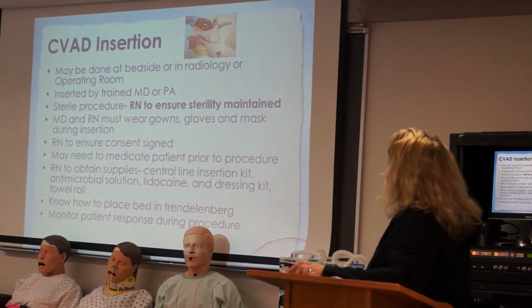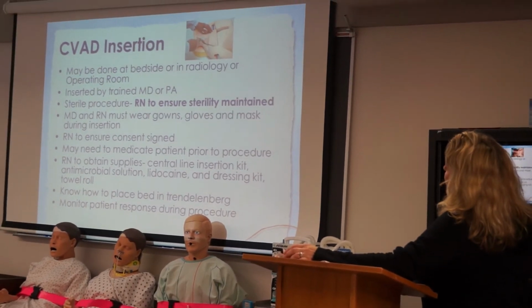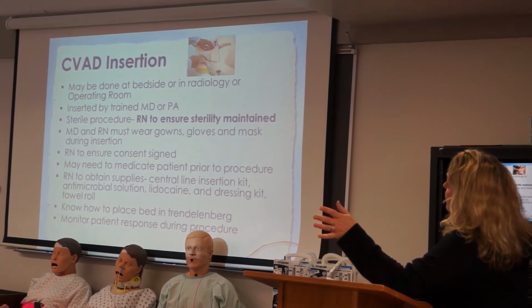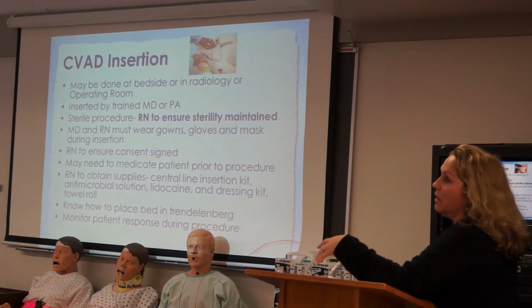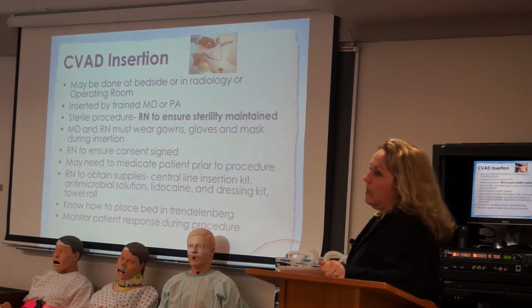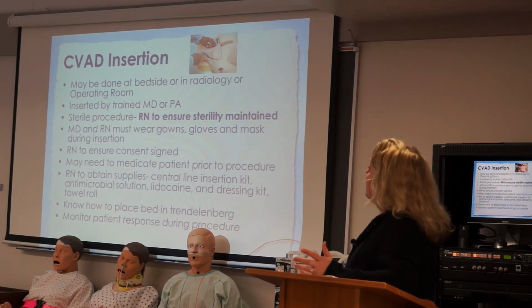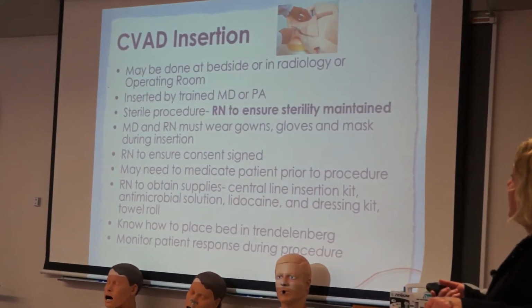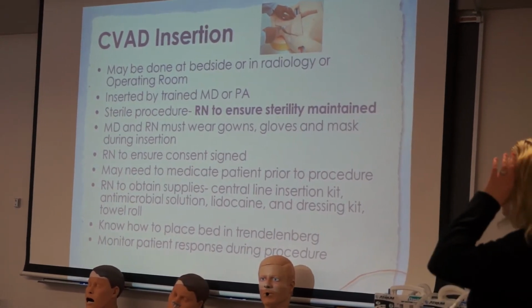All right, central venous access device insertion. This is usually done at bedside or in radiology or in the OR. These can be done especially at bedside in the ICU or in the ER. When I worked in ICU, we would have central lines put in at bedside frequently. And then if you're a PICC nurse and you have a PICC team at your facility, then the PICC lines are done at bedside all the time, especially in the ICU setting, or patients are brought down to your unit and you put them in while the patient's laying on a gurney.